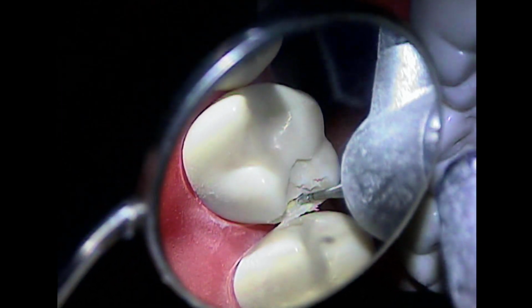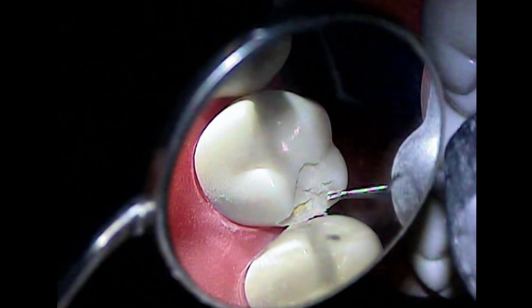Like the angulation, it went wrong. Yeah, that's because you were looking the wrong way. Yes. It's always the way it is.